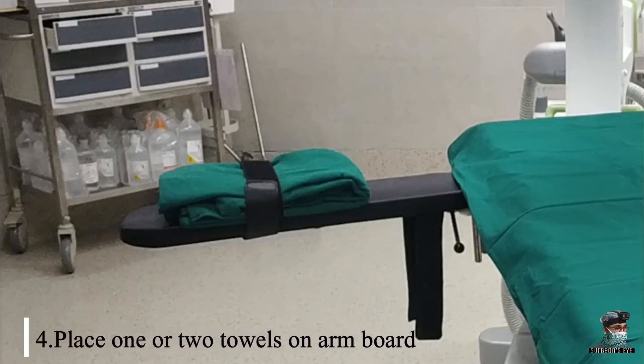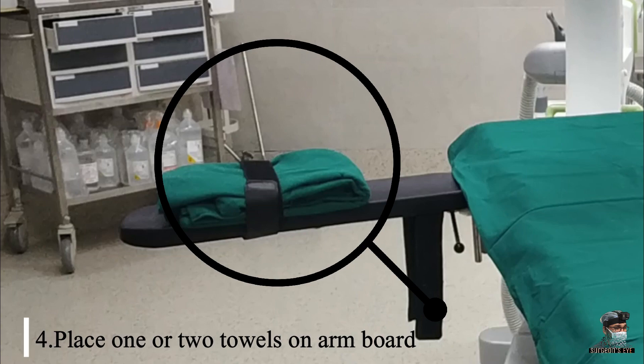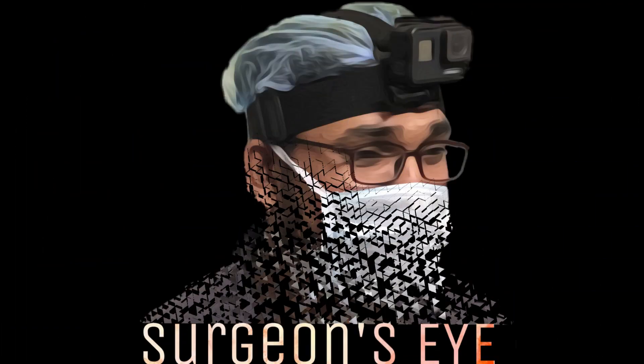The fourth thing is to have the armboard over which one or two towels are placed, so that the most common deformity of proximal humerus fracture — that is, apex anterior deformity — can be nullified. I do most of my surgeries under general anesthesia, so I give certain instructions to my anesthetist.